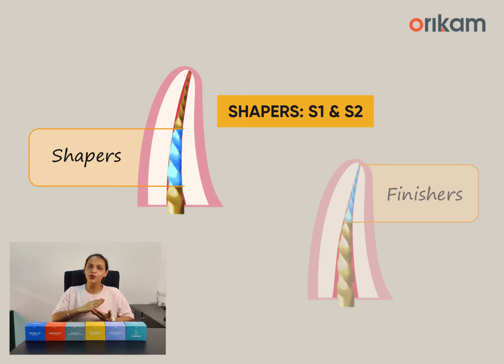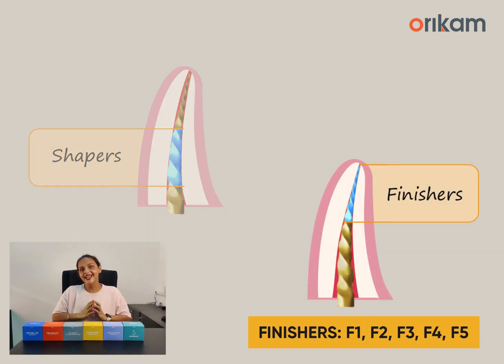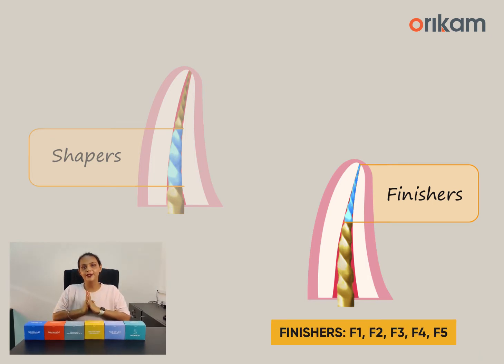The shapers work only in the coronal and the middle third without touching the apical third of the root canal system. This means that the entire load of cutting the dentine is transferred onto the bigger, efficient blades of the shaper files. Whereas the finishers are designed in such a way that they only shape the apical third of the root canal without pre-enlarging the coronal and the middle portion. This reduces the chances of taper lock.